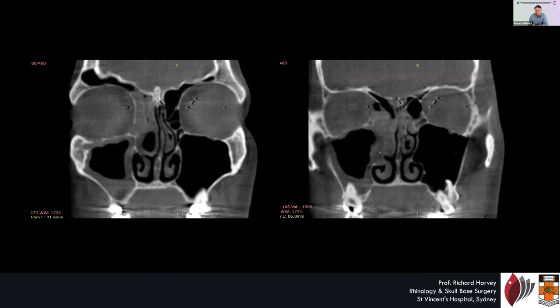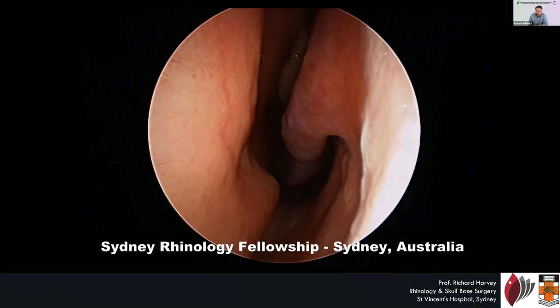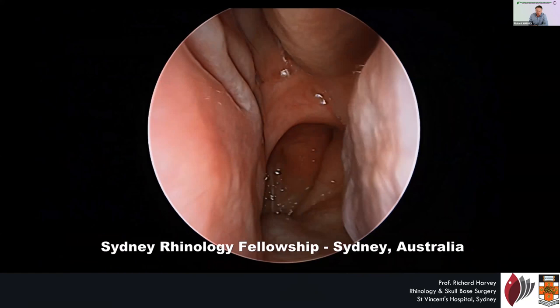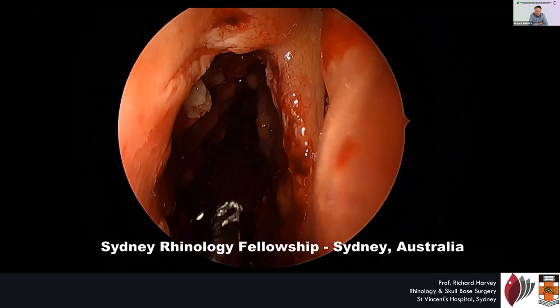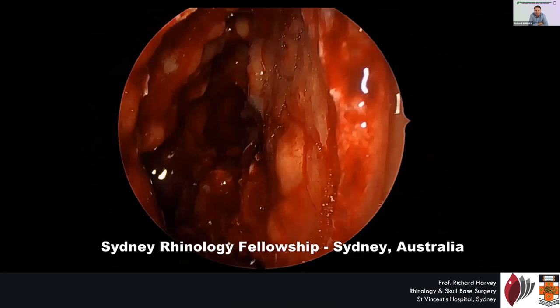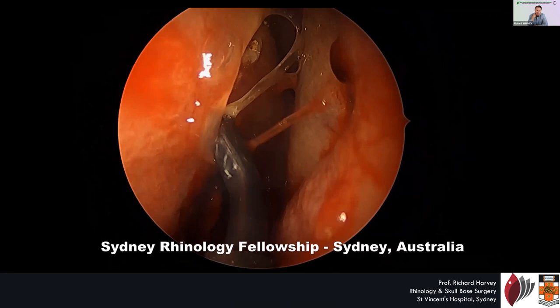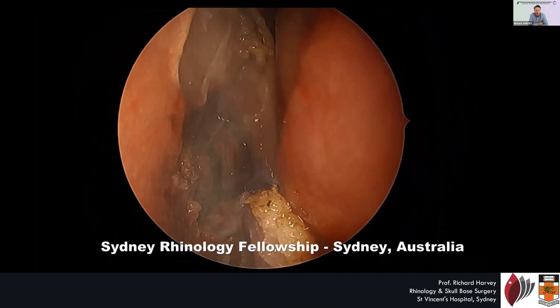Here's a gentleman who has the so-called CCAD — we're going to talk about this in my next lecture. He's got terrible barotrauma; he even gets pain in his V2 division when he flies, and even gets numbness on his face. There's not a huge amount to see endoscopically — just the classic middle turbinate edema that you see in central compartment atopic sinus disease. Here we are at the end of the case where we've done the sphenoethymoidectomy, and we're going to now do the frontal sinus.